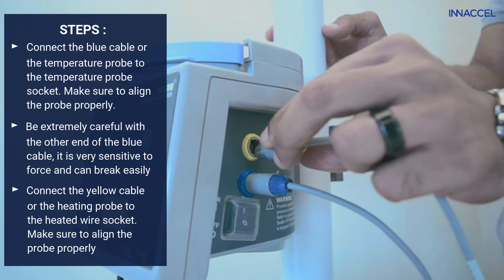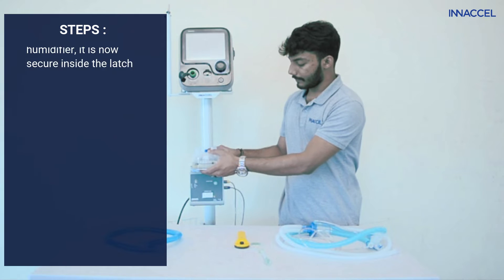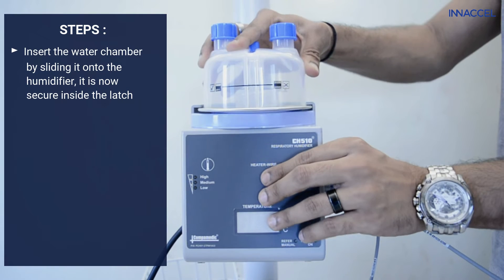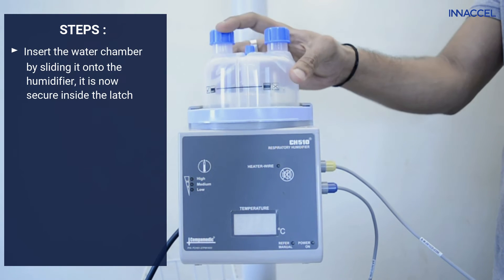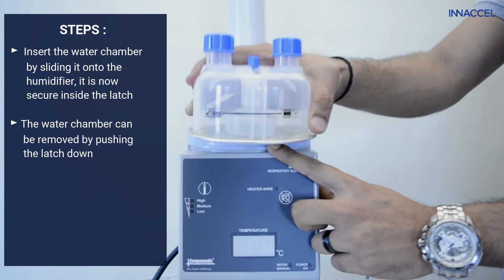Connect the yellow cable, or the heating probe, to the heater wire socket. Insert the water chamber by sliding it on to the humidifier — it is now secure inside the latch. The water chamber can be removed by pushing the latch down.